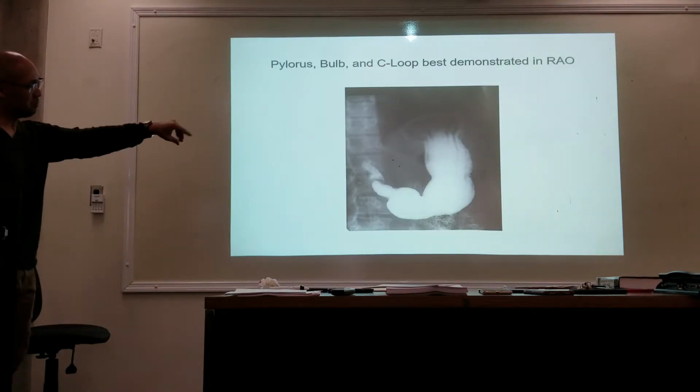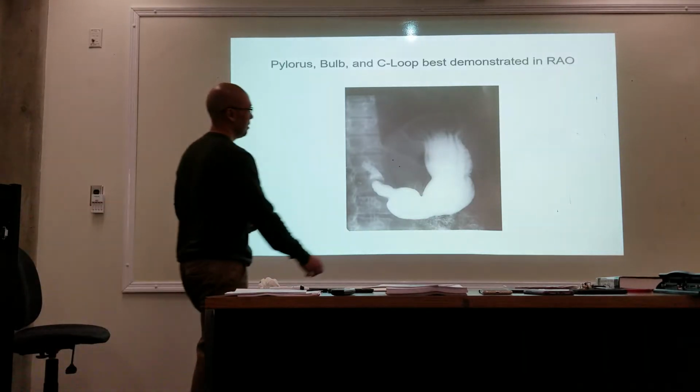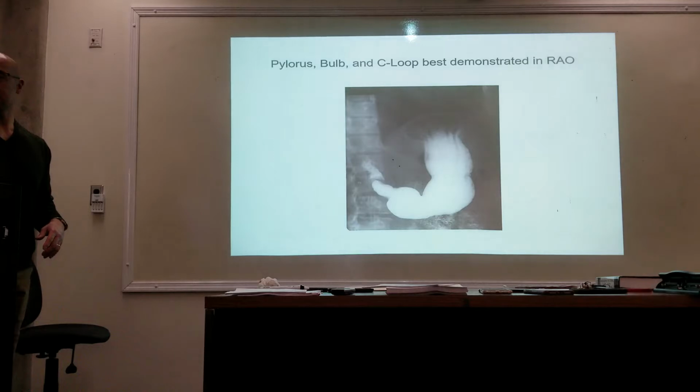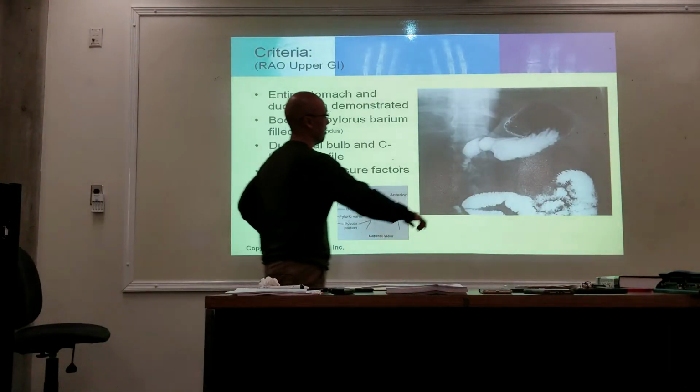Can you guys see some of the rugae going on there? Kind of see it. This patient needs more air. They burped it out. Okay, this is a little bit better. You can really see the rugae here.